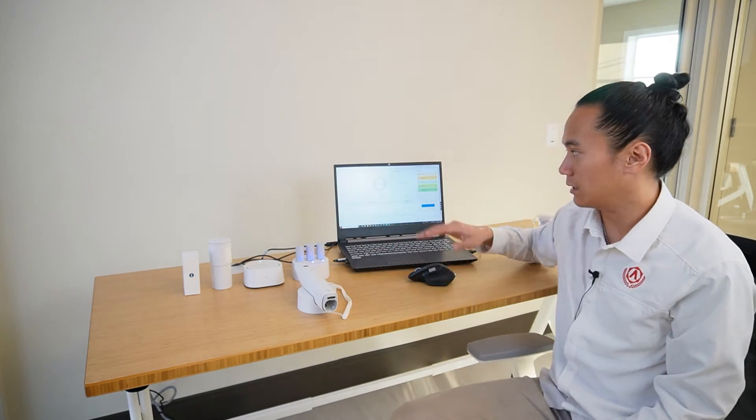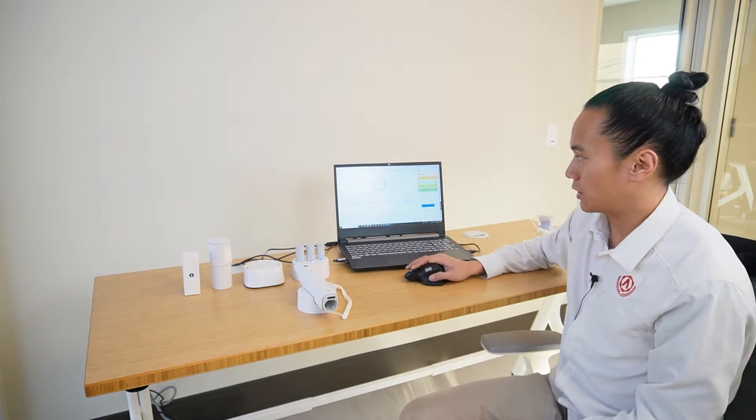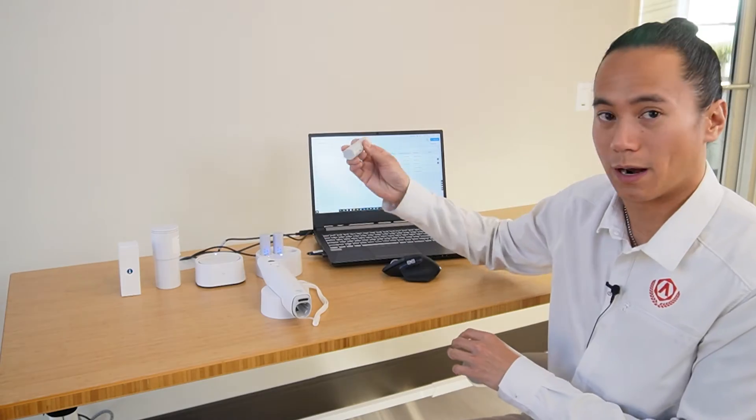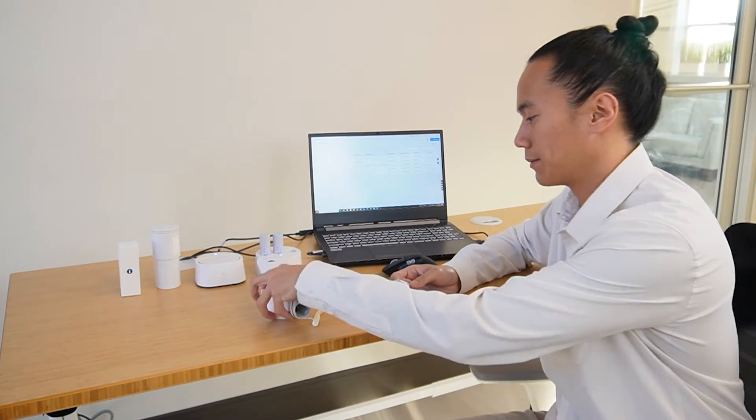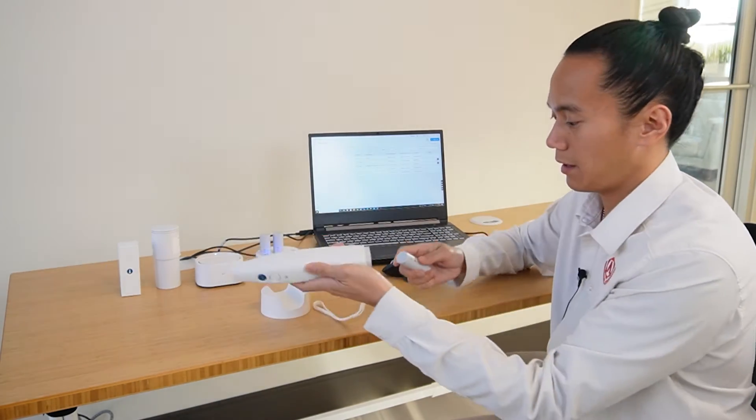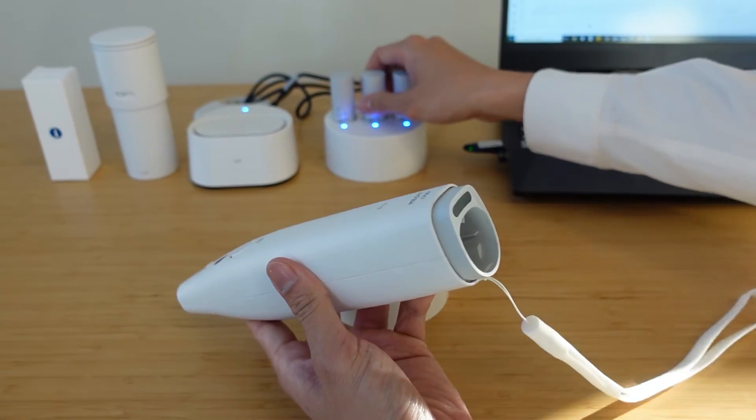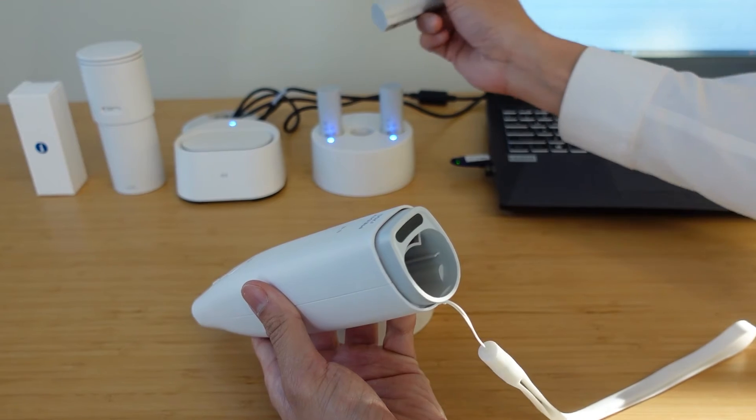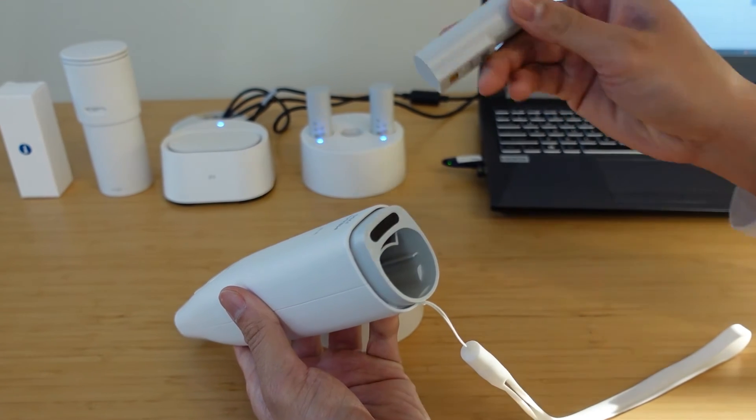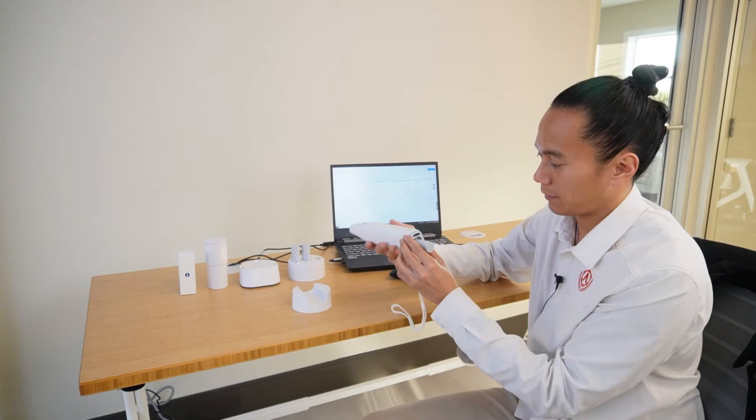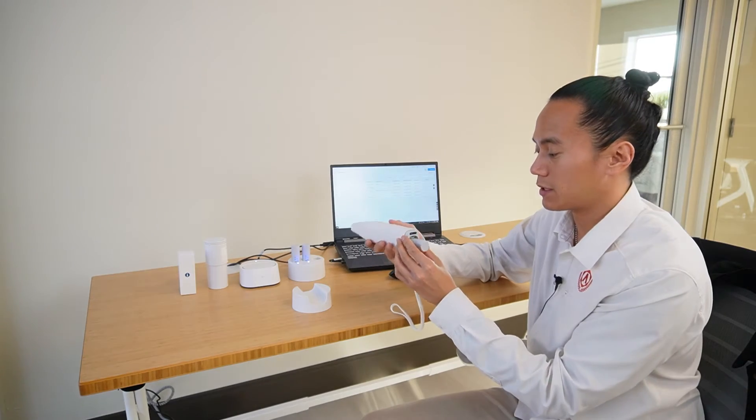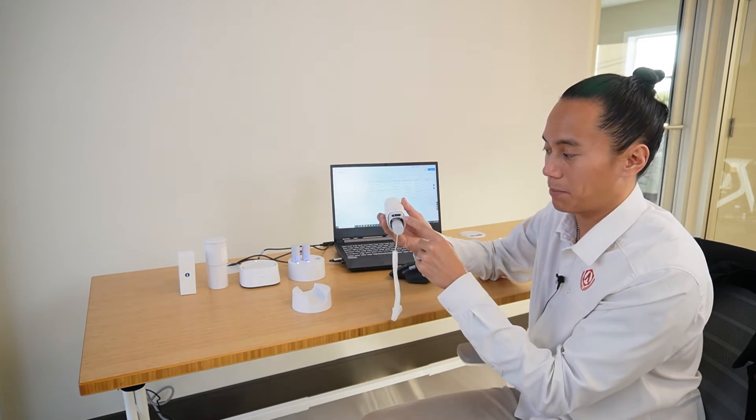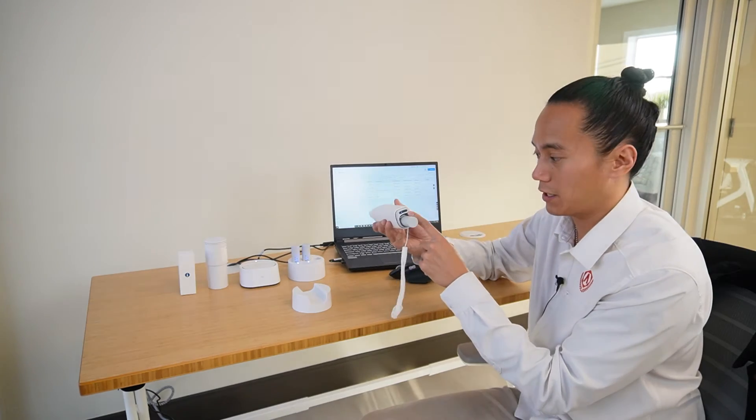Once everything is plugged in and your scanner has been registered, we're going to start the calibration process. We're going to grab one of the batteries and place that into the scanner. Turn on the scanner with the power button on the back. You're going to notice the battery life at the bottom of the scanner here.